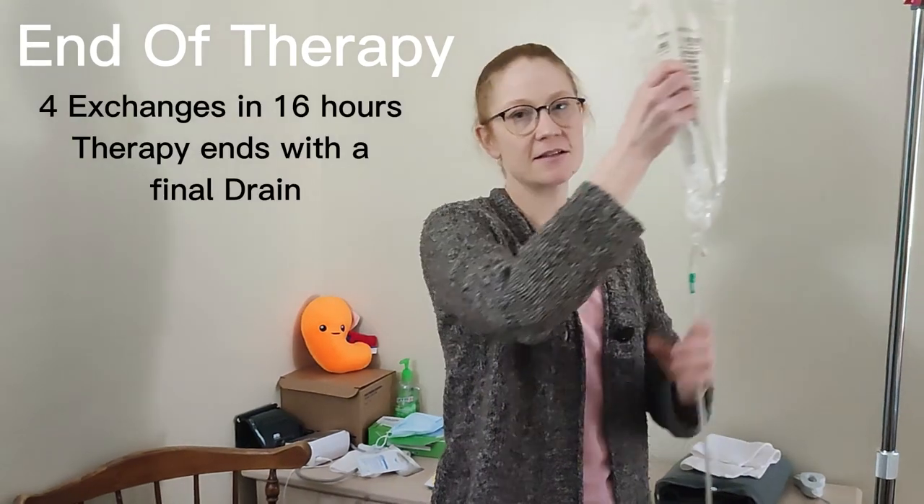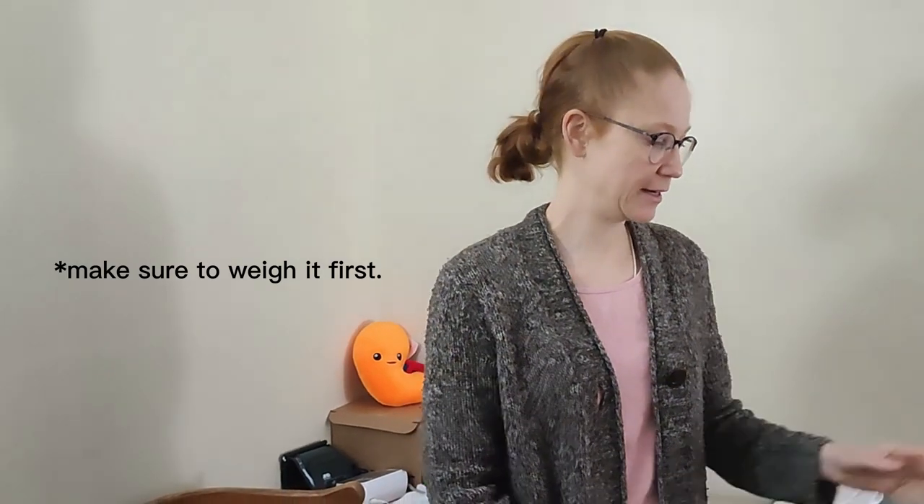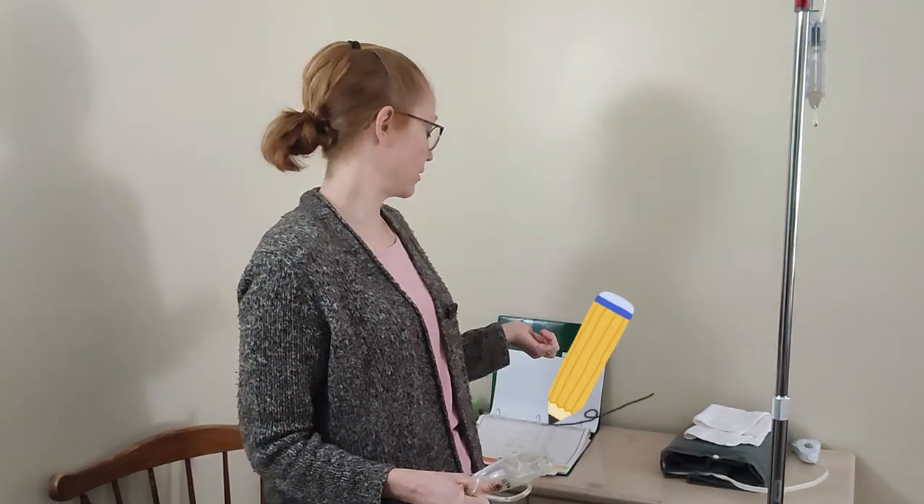I have now finished therapy for the day, so I'm going to take this all down. I'm going to drain what's in the drain bag in the bathtub — that's where I drain it — and put everything away until tomorrow when I need to start again. I'm also going to take my blood pressure again before I go to bed and write that information down.